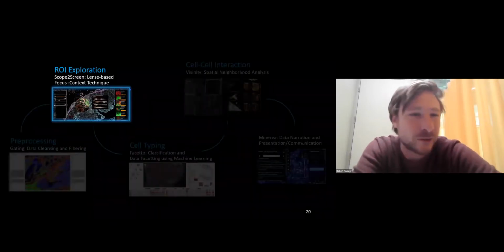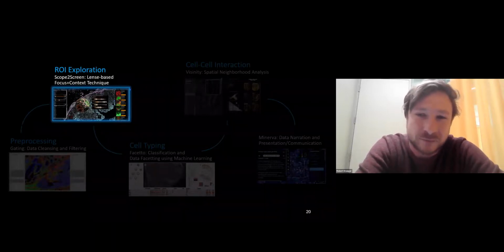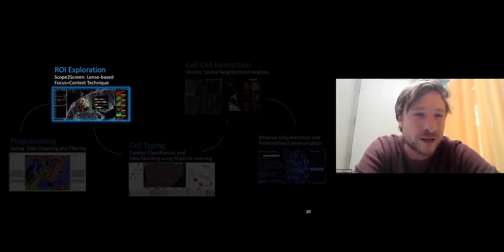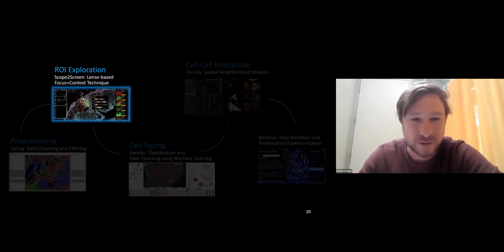The next approach I want to look into with you is region of interest exploration. This is more addressing the typical exploratory process a pathologist would usually do manually by looking through a microscope, and we try to mimic that and bring that more to the digital environment.